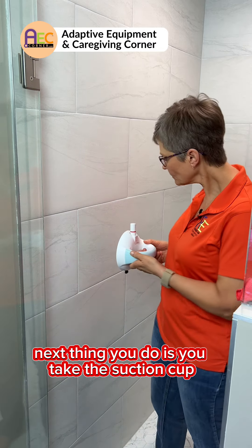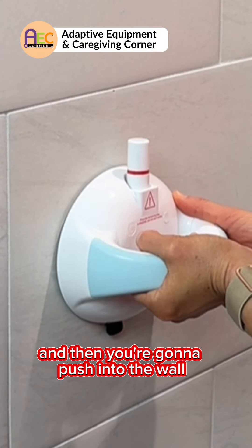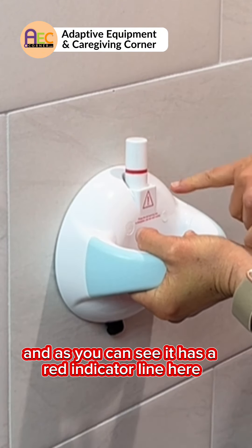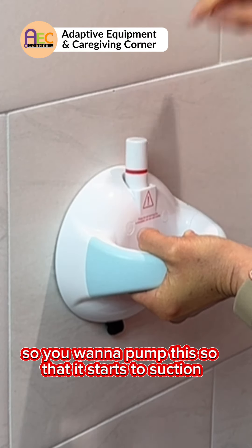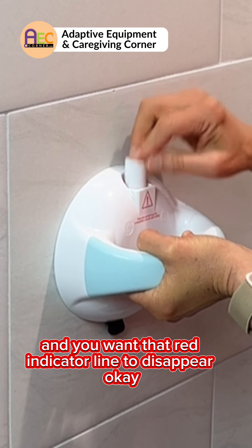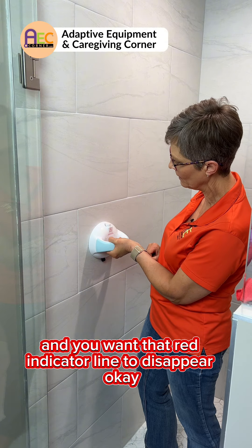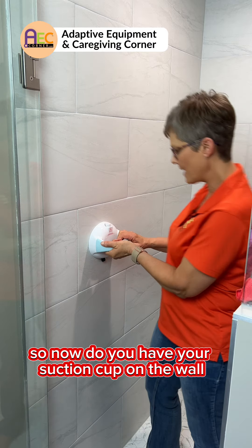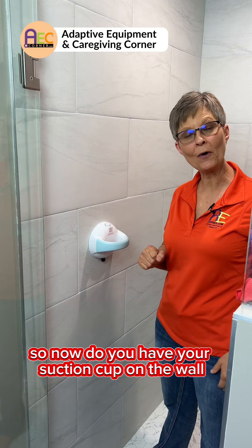Next, you take this suction cup, place it, and push into the wall. As you can see, it has a red indicator line here. You want to pump this so that it starts to suction, and you want that red indicator line to disappear — just like that. So now you have your suction cup on the wall.